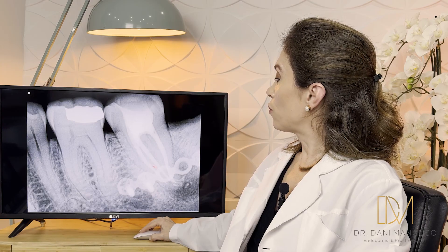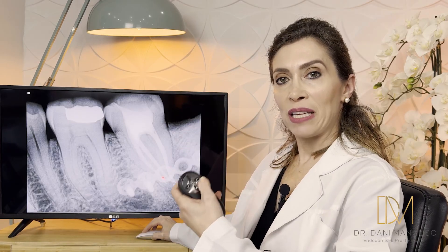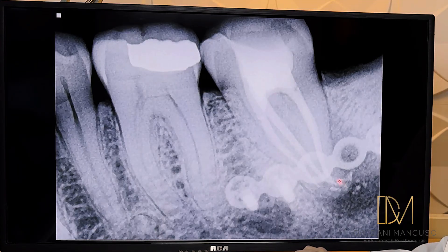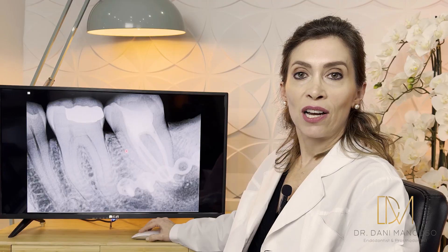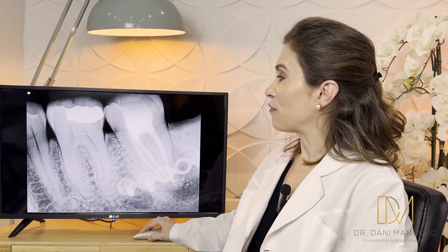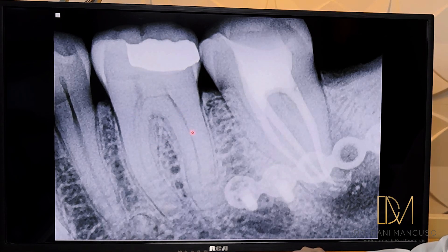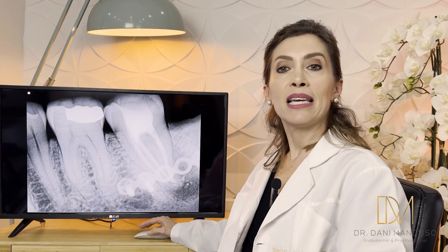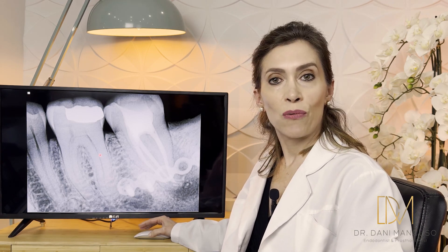In this case, you might have thought that the canals were joined. But when we move that interference out of the apical portion, we can see that the apex is more complex than we thought, although it looks like a uniradicular tooth. It's completely different from a six, for example, which has two or three roots — in this case, three canals are at least visible on the periapical x-ray. Again, if you take a CBCT you can see that in advance, but I understand that's not a reality for every practice.